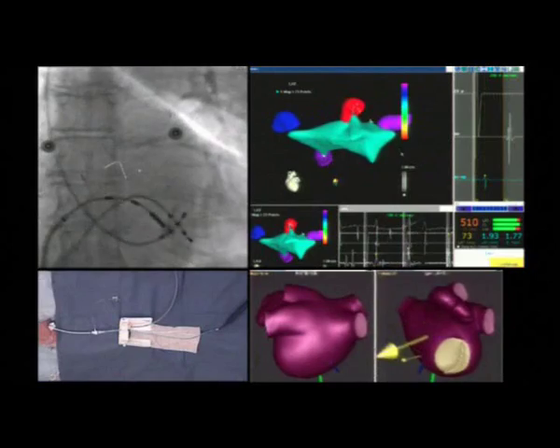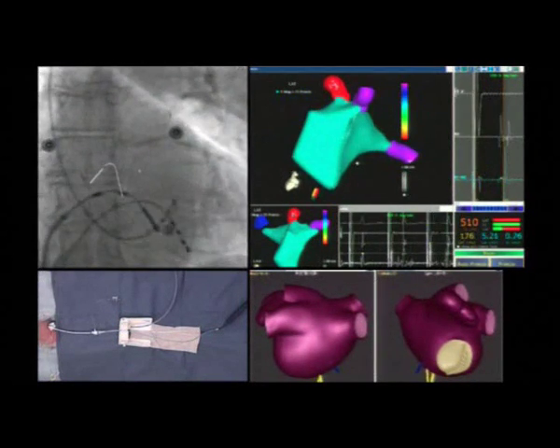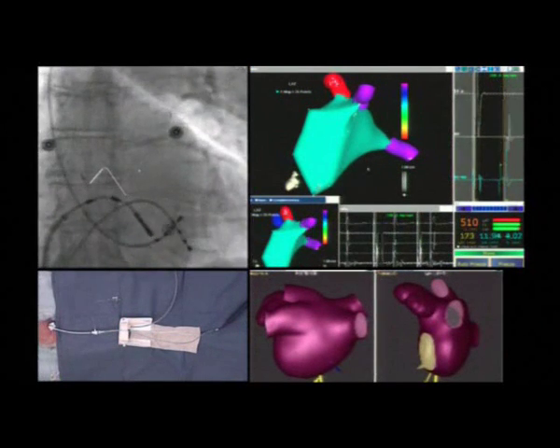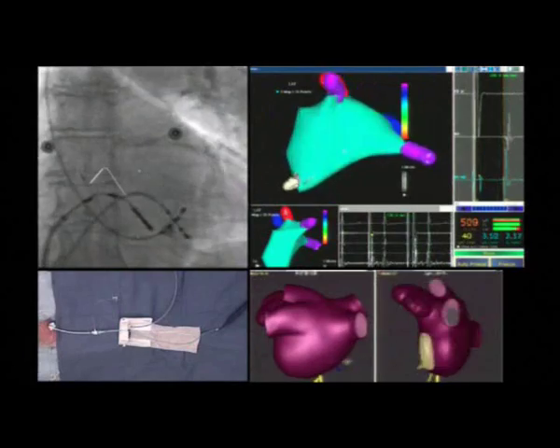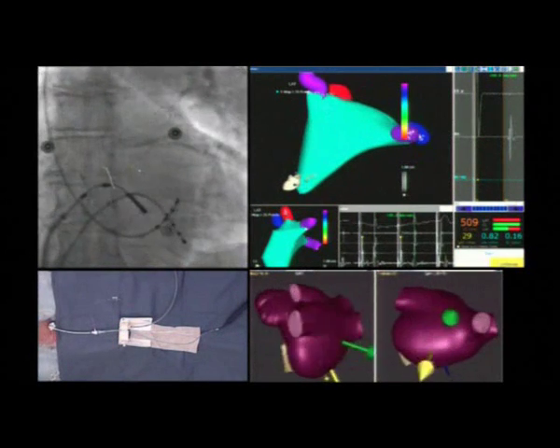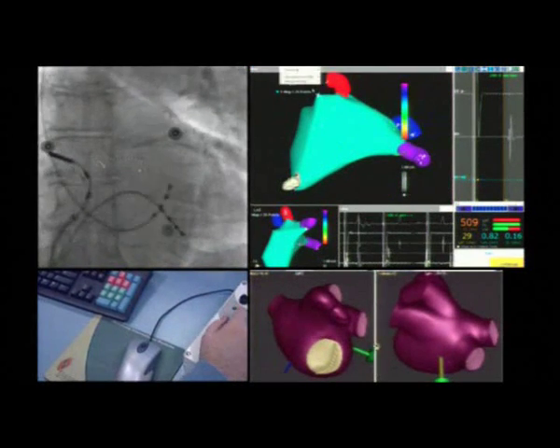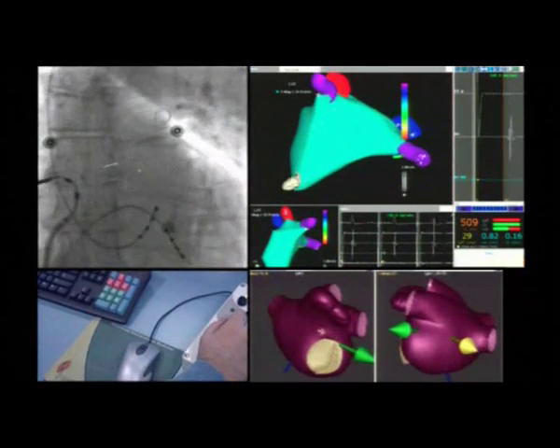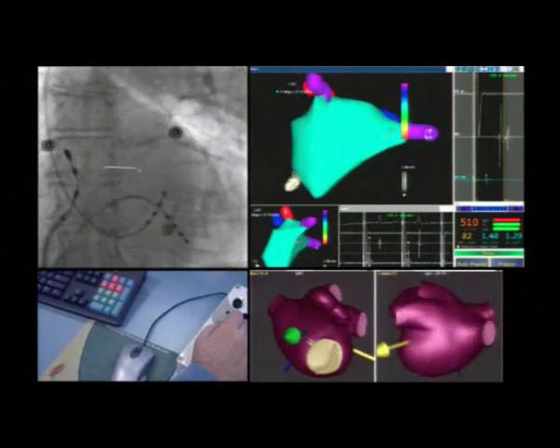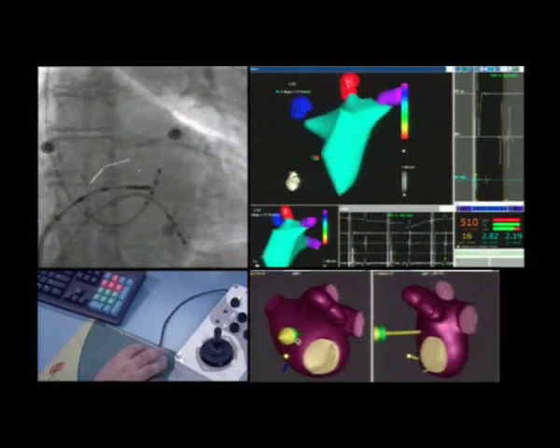Note the green and yellow arrows on the Navisphere screen. The green arrow represents the desired direction and position that the catheter needs to reach, whereas the yellow arrow is the direction of the magnetic field generated by the two magnets next to the patient, moving towards the desired direction represented by the green arrow. As the yellow arrow moves towards the green one, the magnetic field is constantly applied in order to allow the catheter to reach its final position in just a few seconds.